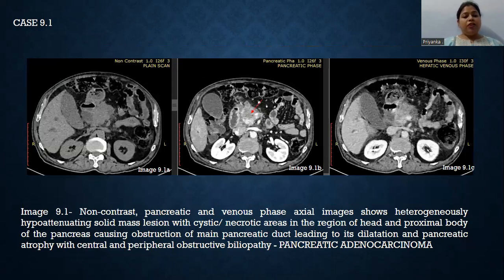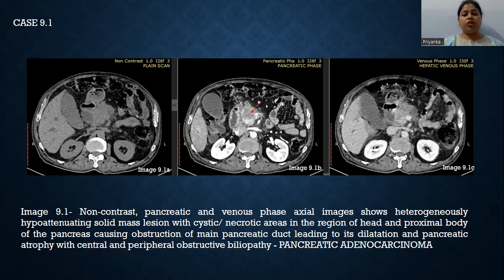This slide shows non-contrast, pancreatic, and venous phase axial images demonstrating a heterogeneously hypoattenuating solid mass lesion with cystic or necrotic areas in the region of the head and proximal body of the pancreas, causing obstruction of the main pancreatic duct leading to dilatation and pancreatic atrophy with central and peripheral obstructive biliopathy. These findings are suggestive of pancreatic adenocarcinoma.